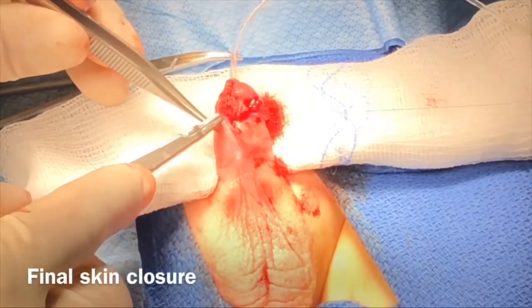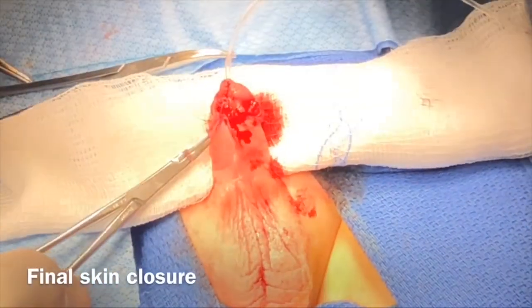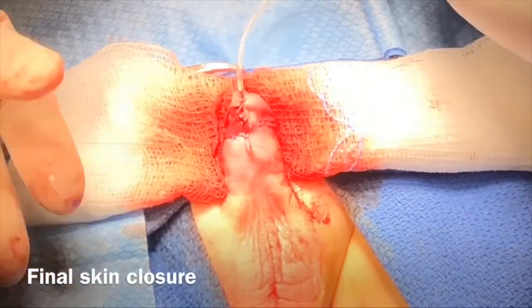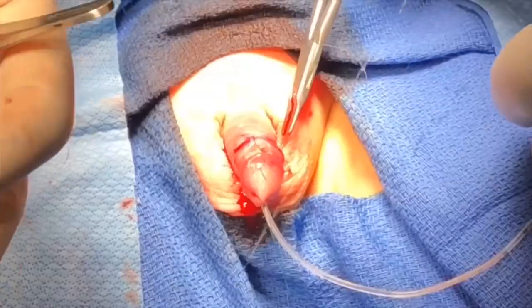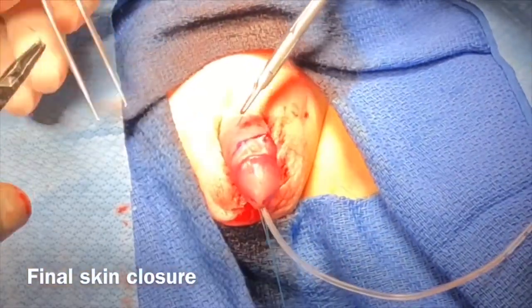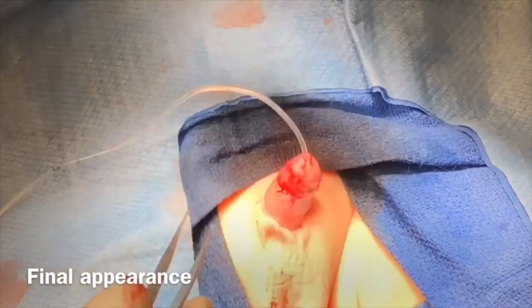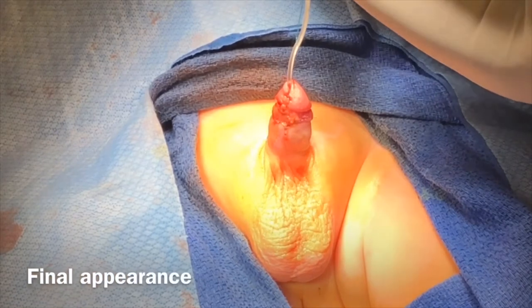Approximation of the skin to mucosa is performed with interrupted 6-0 PDS sutures. It is worth noting that there is almost more than 50% resident participation in this procedure.